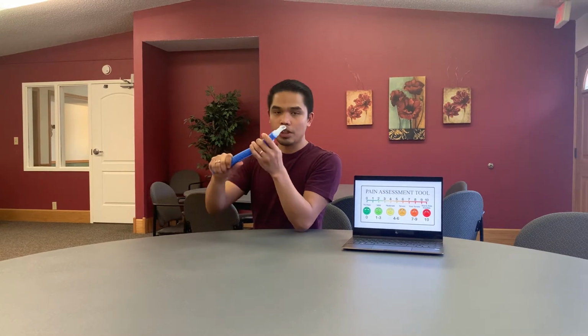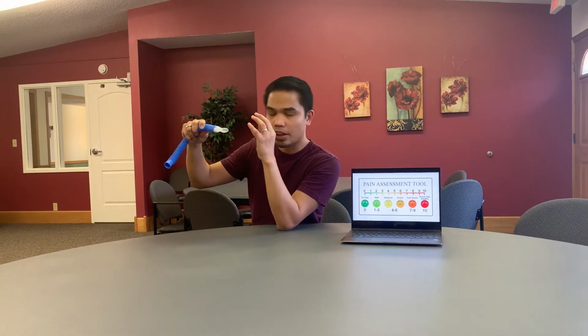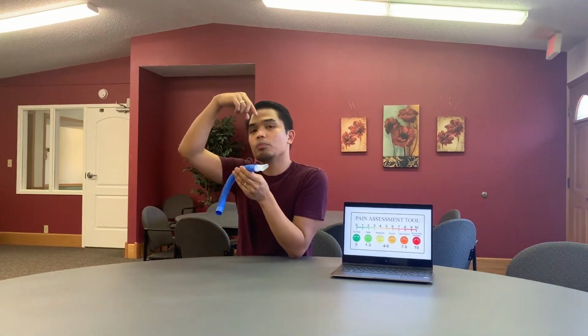Assuming the patient is inside the body box or the plethysmograph, or using a portable PFT, there will always be a mouthpiece. With the mouthpiece, ensure the patient takes a good seal on it with no leak on the sides, with their tongue underneath so it does not block the airflow. We will also put nose clips on their nose so that there will be no leak.